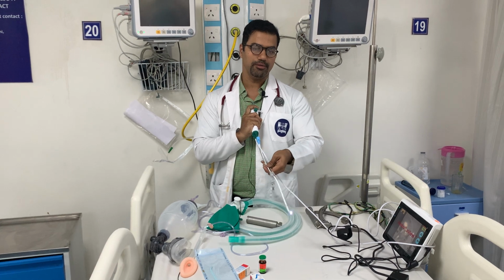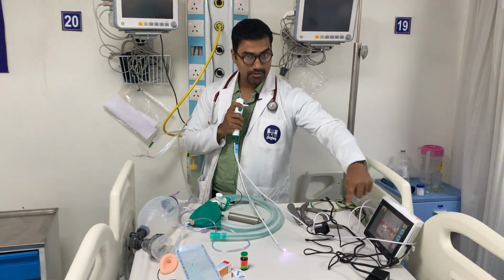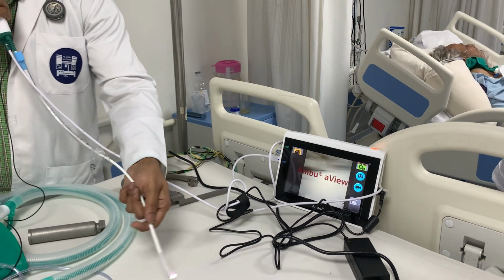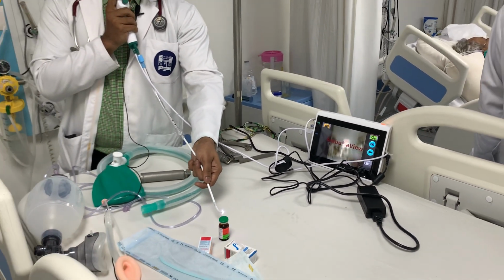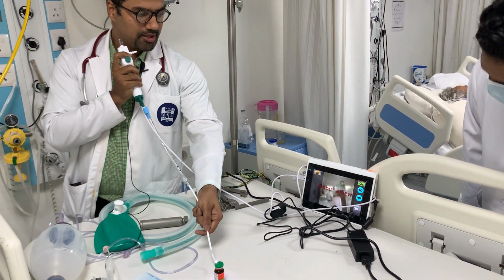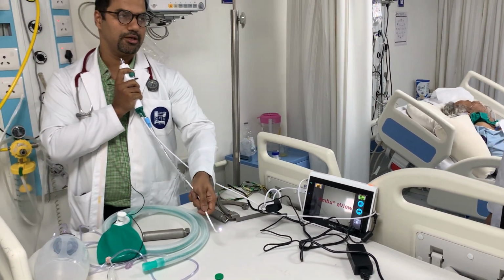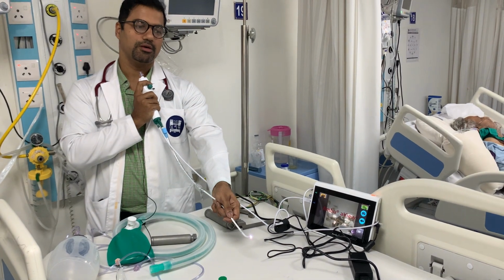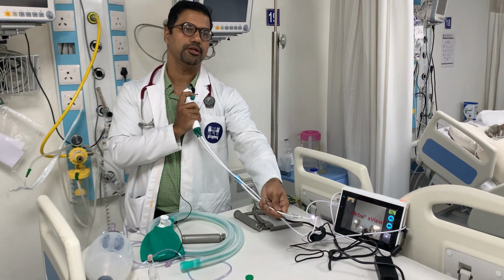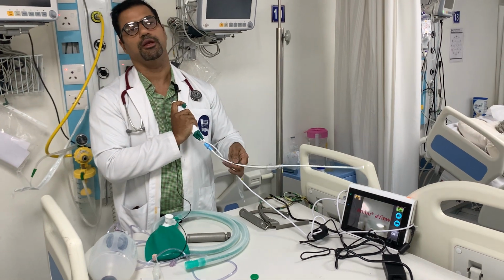You just need to railroad this endotracheal tube on it, go through the oral cavity, you will see the vocal cords. Just show here. This is what will be visible here. So once you go here, see the visibility is good. Someday we will have a live session on fiber optic laryngoscope on a patient, but as of today I can just show you this much, that you should go in through the oral cavity, push it anteriorly and then go. You will see the vocal cords. Once the vocal cords are visible, go inside, trace till the carina and then railroad the endotracheal tube. Okay. This is the most definitive way that you can secure an airway.